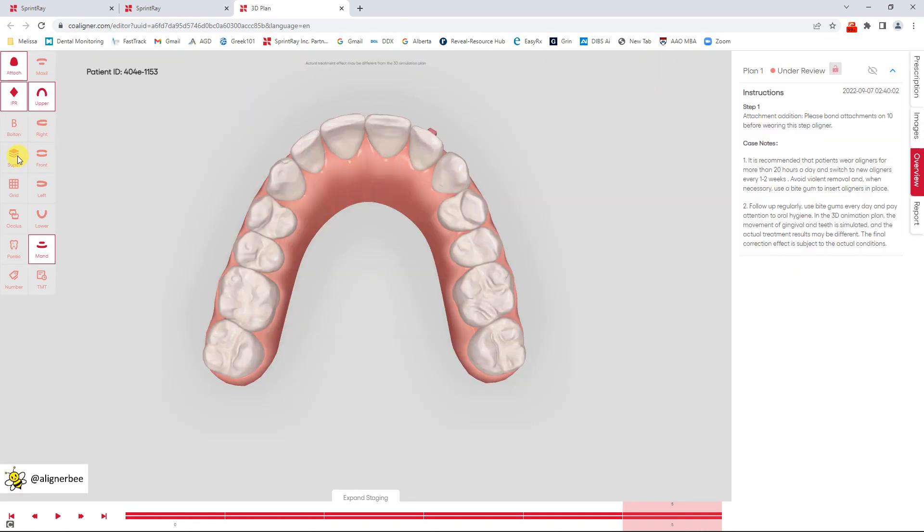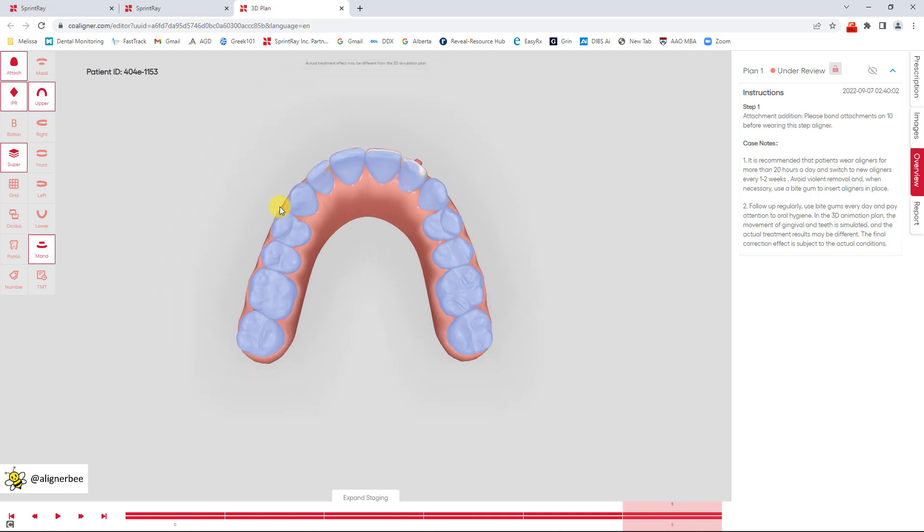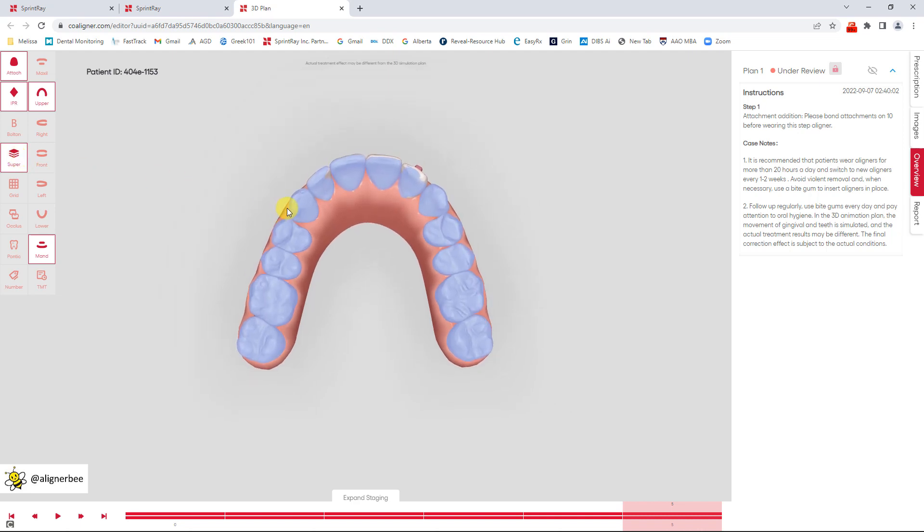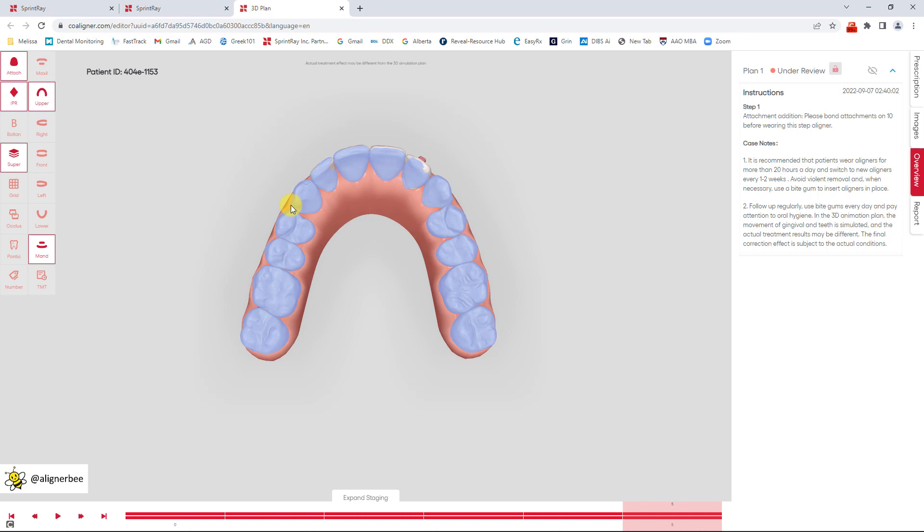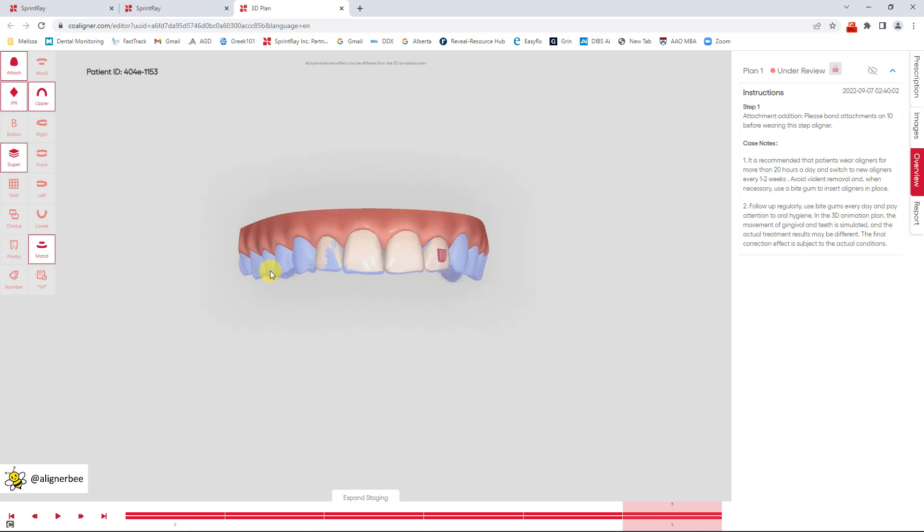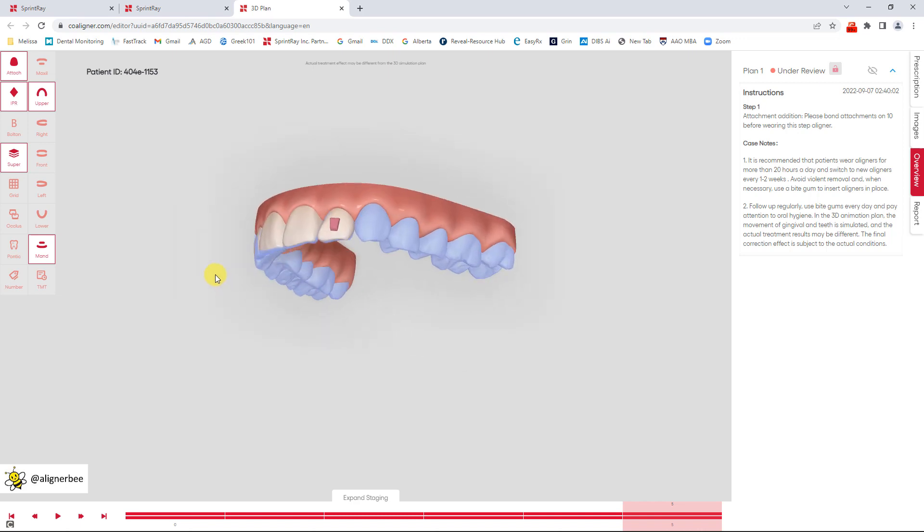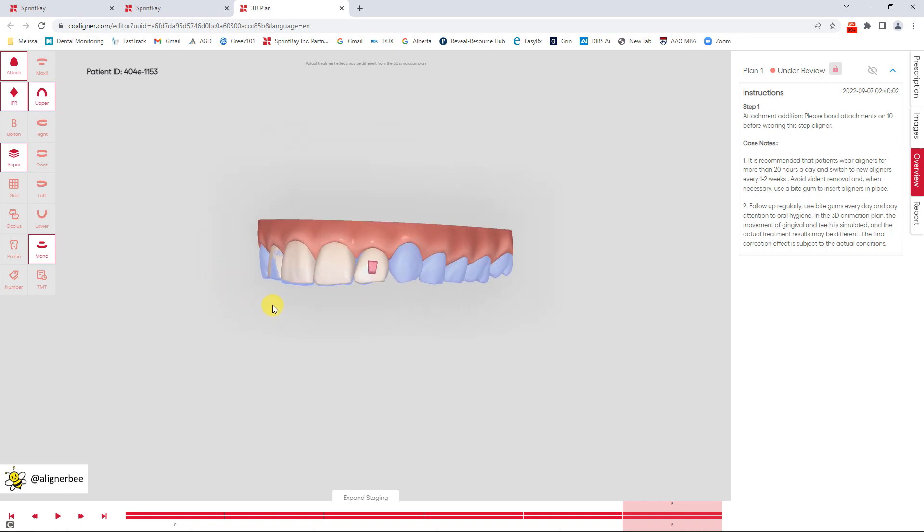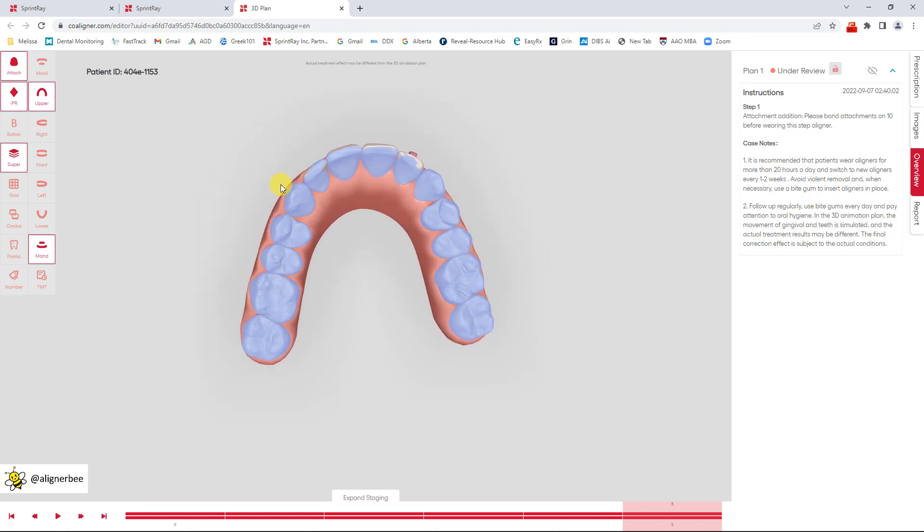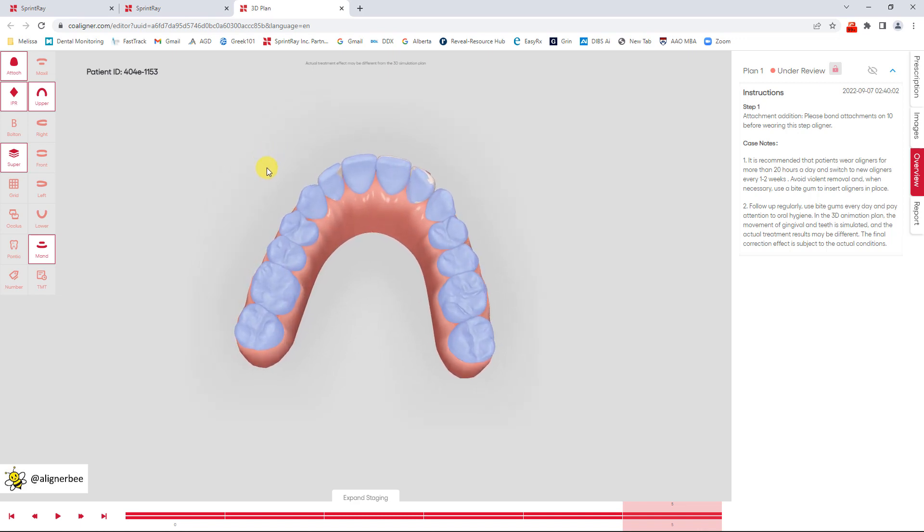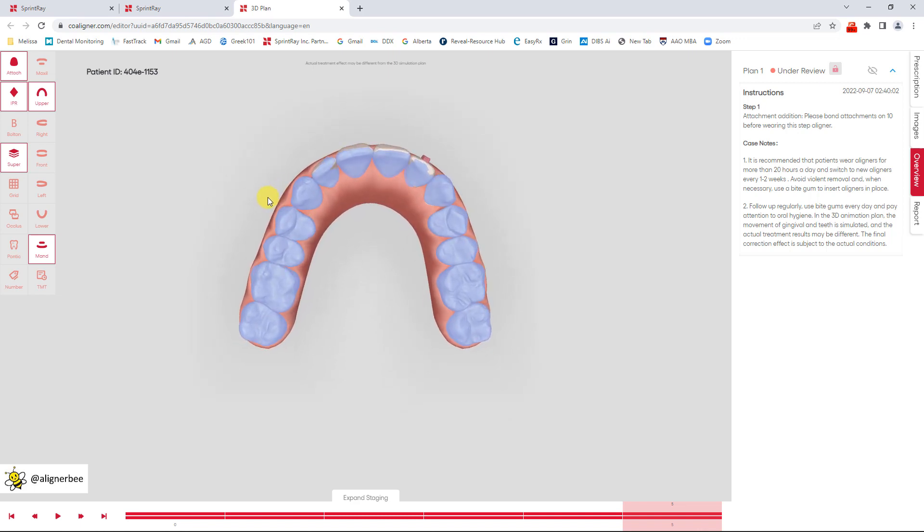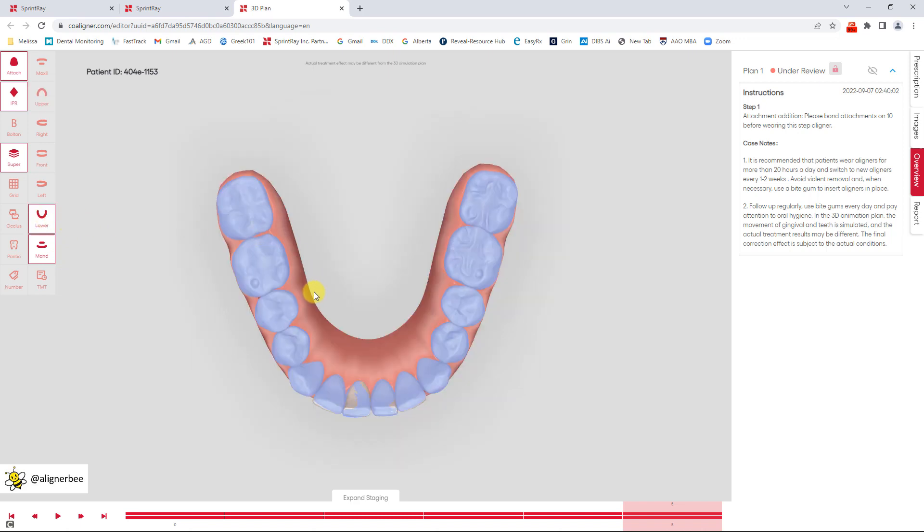I also really like to look at my cases with superimposition. So it'll show me the initial starting point and the final starting point for my patient. We can see here just predominantly movement in the anterior teeth but it gives a great visual so that I can see the movement that's planned and I can also explain that to my patient if they have any questions.